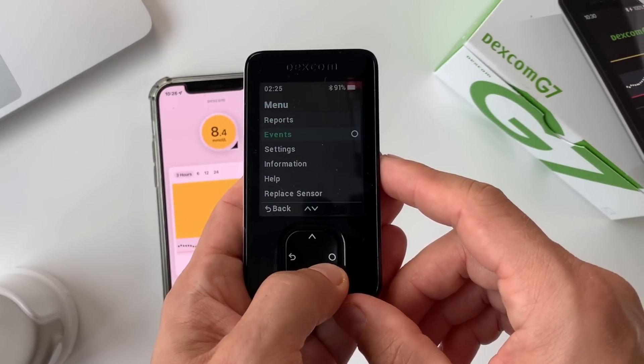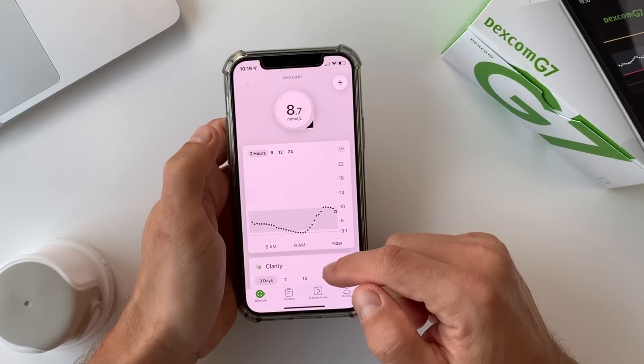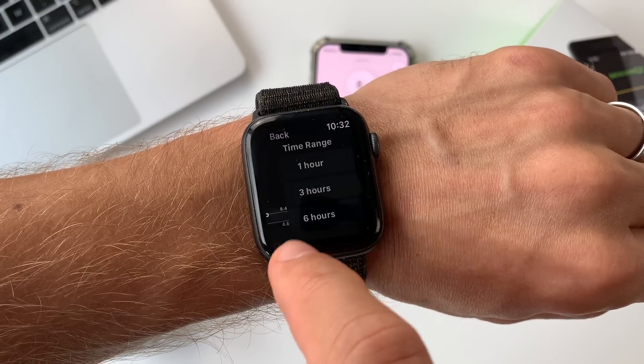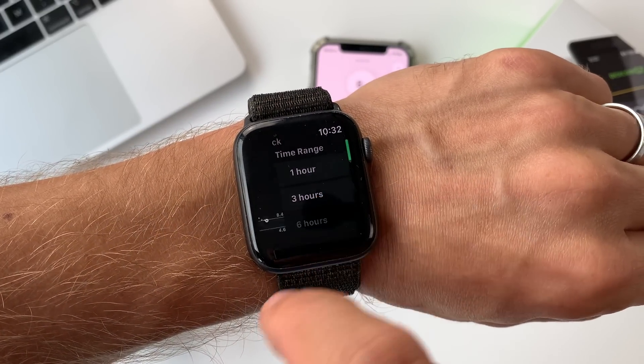You don't really need the receiver because the new Dexcom G7 phone app has some major upgrades. It's been fully redesigned and now includes both real-time and historical data, which previously was only accessible in the Clarity app. Both the phone app and Apple Watch app got a new look, and I have to honestly say I'm pleasantly surprised — they both look very sleek and modern, not like a medical device anymore. Not many companies in the diabetes space create such a seamless user experience as Dexcom seems to have done with the G7.